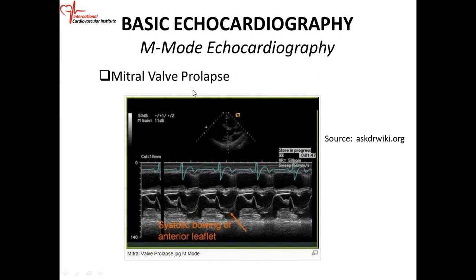All right, so you have your two-dimensional echo on top. Your cursor is crossing these structures here. The first structure it encounters: chest wall, the pericardium, the RV wall, RV cavity, septum, LV cavity, and the mitral valve inside the LV cavity. So these are the structures that are depicted below: chest wall, pericardium, RV cavity.